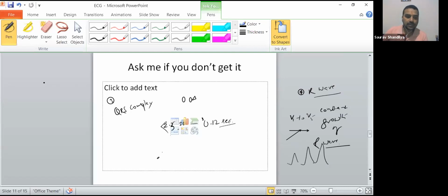And now let us talk about the S wave. I will not tell you much to remember. You can see the S wave generally increases. Sorry, it was T, I'm really sorry. The S wave, yes, this is the S wave. It increases between V1 to V3. If you ask me why it increases and why it decreases, for the past 2 hours I have been discussing how ventricular repolarization and depolarization take place. If you correlate with that, that is your homework. Then you will find why the graph increases from V1 to V3. And it is not seen in V6.